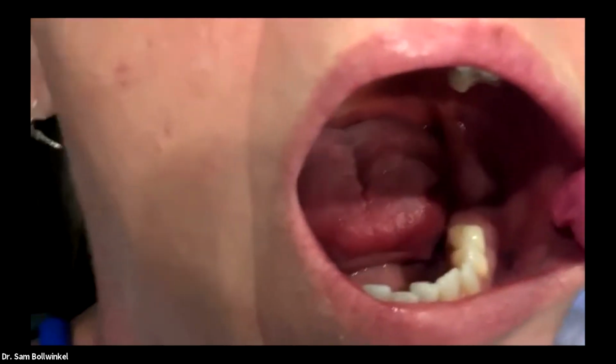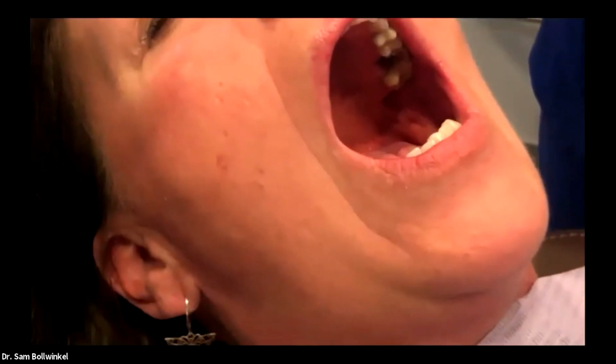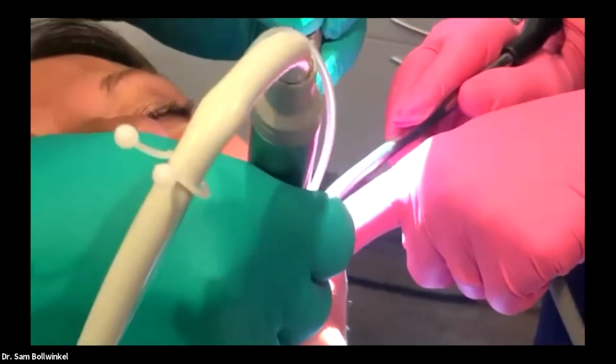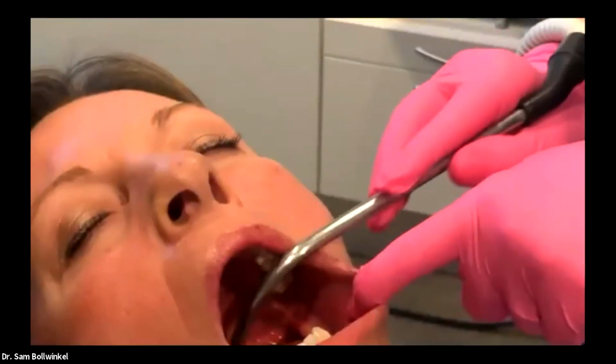As I was doing the osteotomy, the bone felt a little bit weak just in the osteotomy, but that's probably because we have really sharp drills. So in my opinion, I think we've got just a little bit of a premature set from my plan. So I'm letting that set just a little bit. I'm going to back this out just a touch. There we go. We're going to put it back forward now.